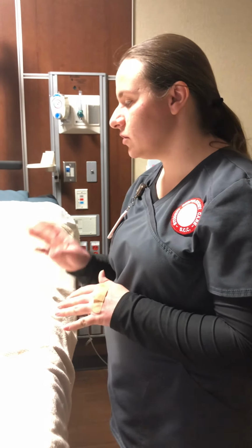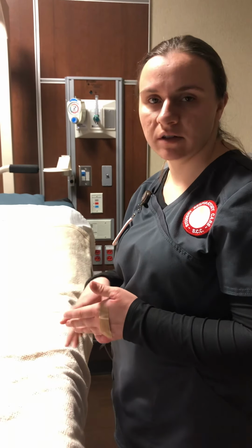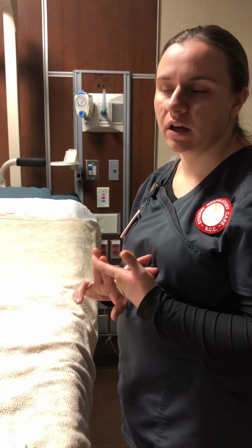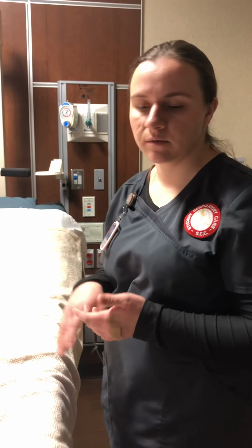And so when I'm finished, I would reassess the patient, listen to the lungs, see if it's helping the patient's lungs, note anything if they cough up anything when they cough, and then I would check their vital signs. After I'm done listening to their lungs, wash my hands, remove my PPE, and then I would go and chart on the patient's charts what kind of therapy I did with them.